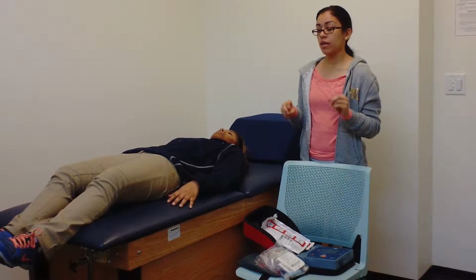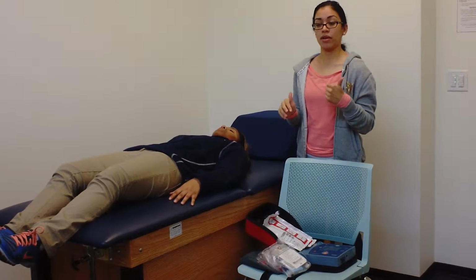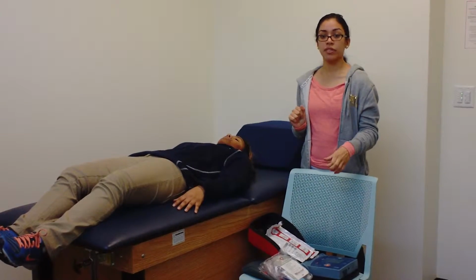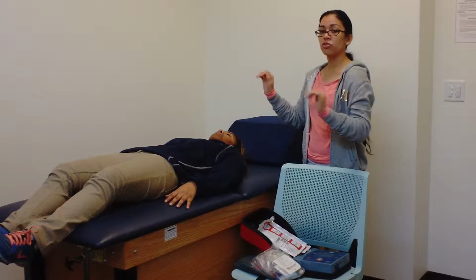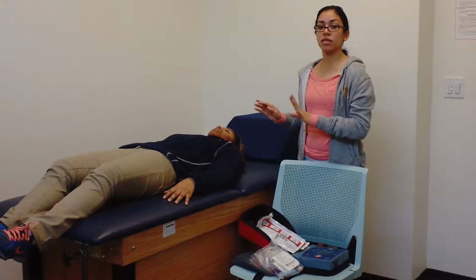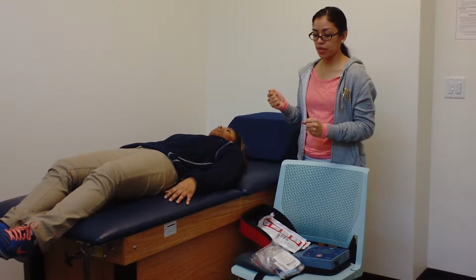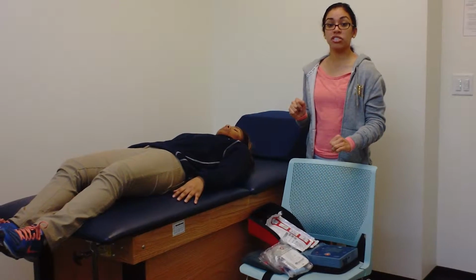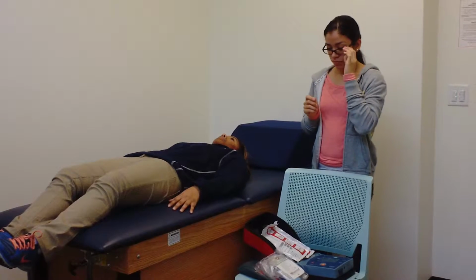I'm going to turn on the machine and it'll give me voice prompts saying it's going to first analyze the heart rhythm. Once the AED has analyzed the heart rhythm, it'll tell me if a shock needs to be delivered. So if a shock needs to be delivered, I'm going to tell everybody, stand clear, nobody touch the patient. We don't want any disturbances with the signal or the shock. That can hurt the other people around as well. So I'm going to press the shock button. The machine is going to say delivering shock, and it's going to deliver the shock.